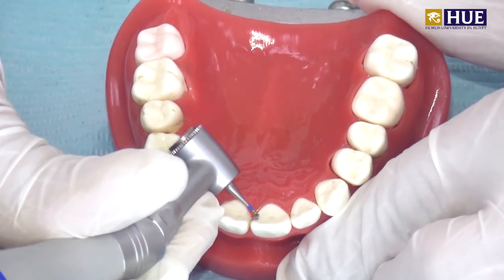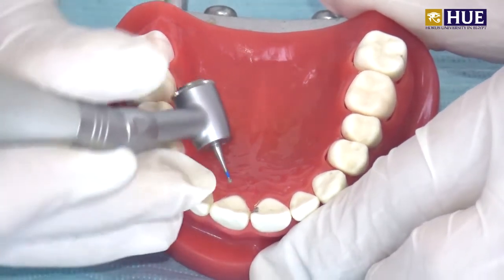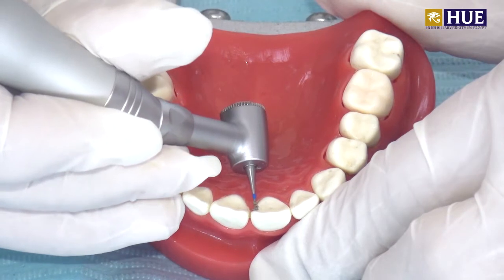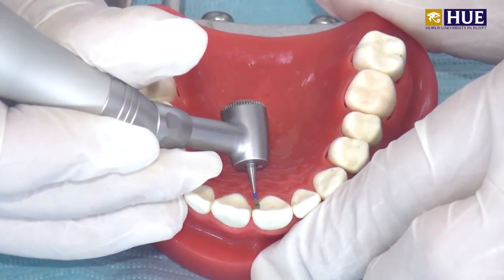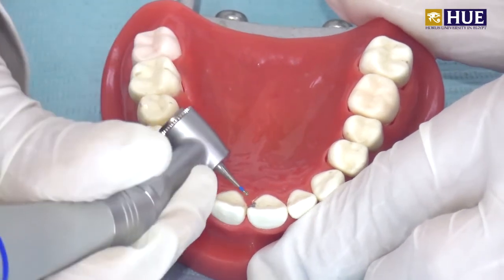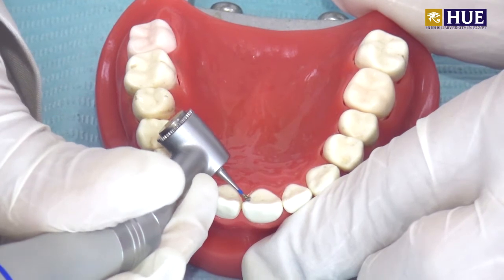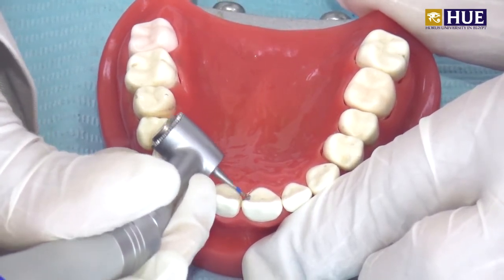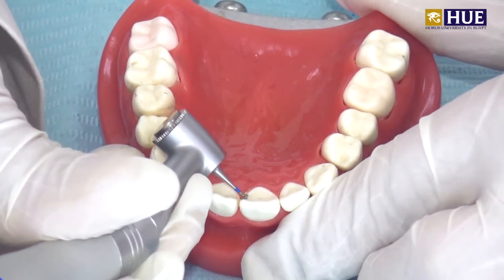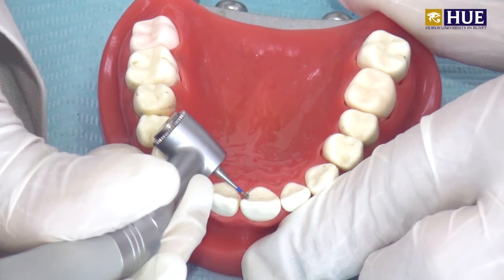This is the right entrance, the right direction of gaining access. On the other hand, if you enter from this direction, it is the wrong direction, because it is not parallel to the enamel rods in this area. So you enter the surface from the mesiolingual direction, or mesiolingual angle, or mesiopalatal angle, as you should say.